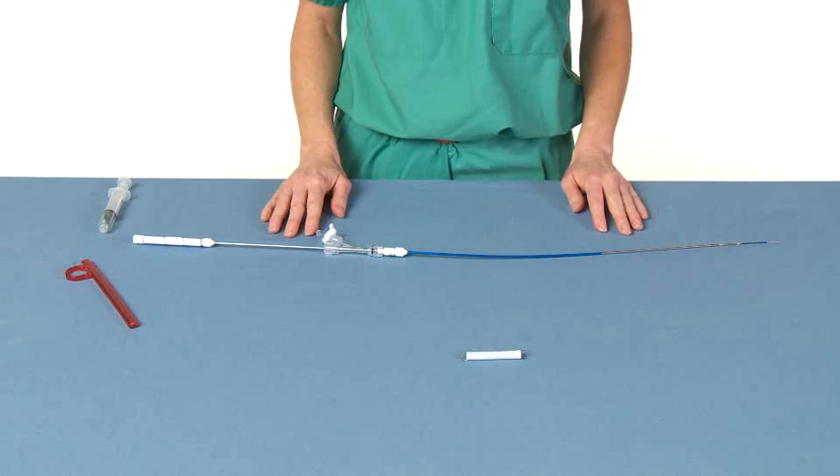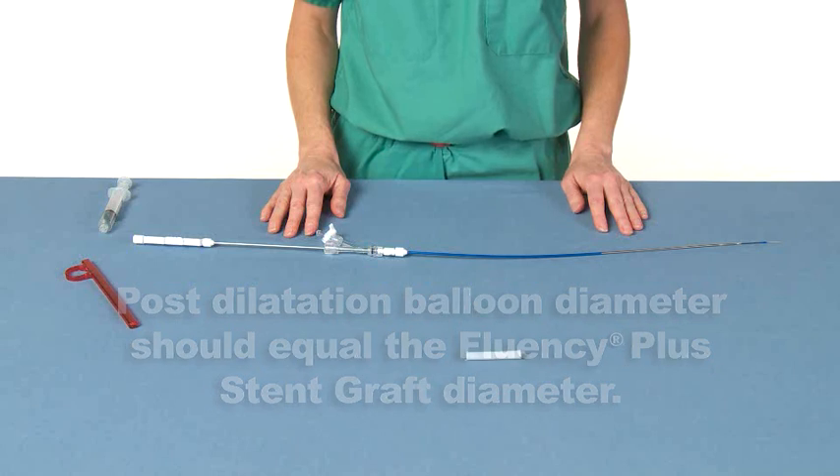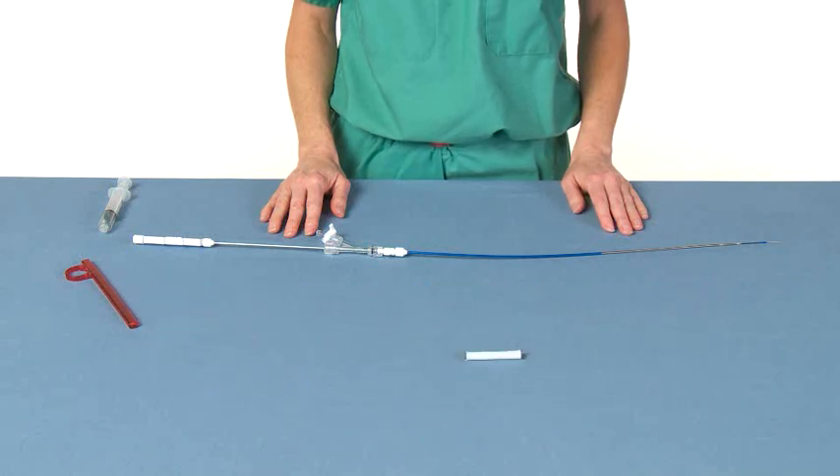During post-dilatation of the Fluency Plus stent graft, the physician should choose a balloon equal in diameter to the diameter of the stent graft. Congratulations! You have just learned how to in-service a clinician on how to prep and deploy a Fluency Plus tracheobronchial stent graft.